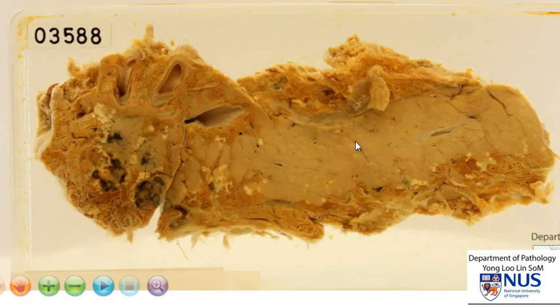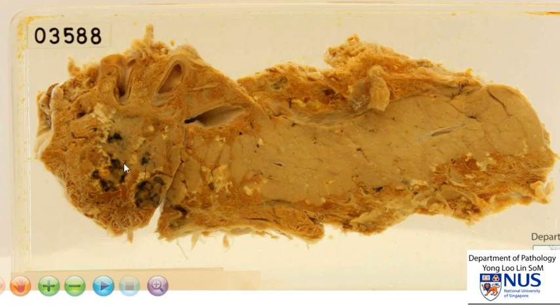To summarize, this is an example of acute pancreatitis. What we can appreciate are these areas of fat necrosis with saponification with chalky deposits. We can also see some areas of hemorrhage, which are likely due to elastase enzymes released from the damaged pancreatic acinar cells.